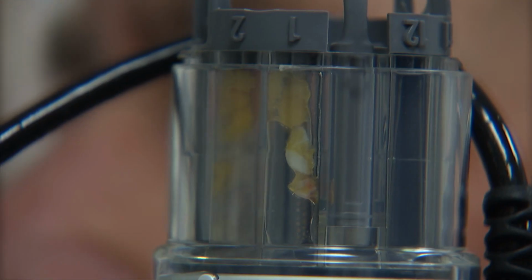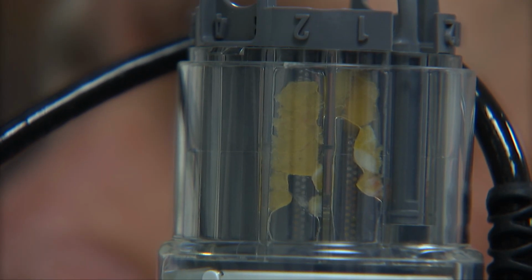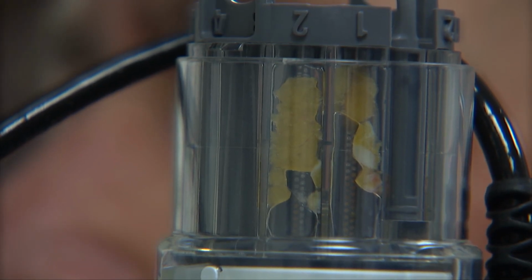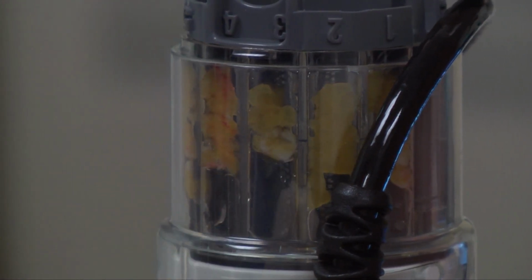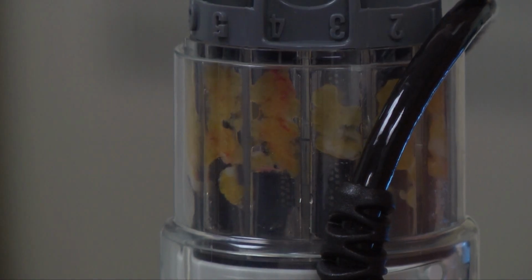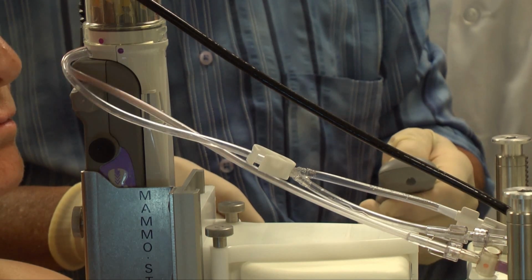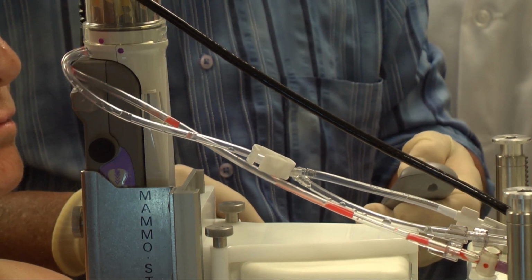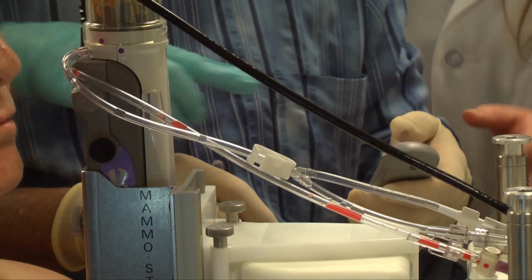Whoa. Okay, the samples are coming in upstairs here. Okay, we're almost halfway done. And you can see the samples coming in. And I'm just holding the button down and moving the clock. So now I'm starting on the odd numbers. We're just going to vacuum once. And then I'm going to dry tap. Then we're going to close the bowl.